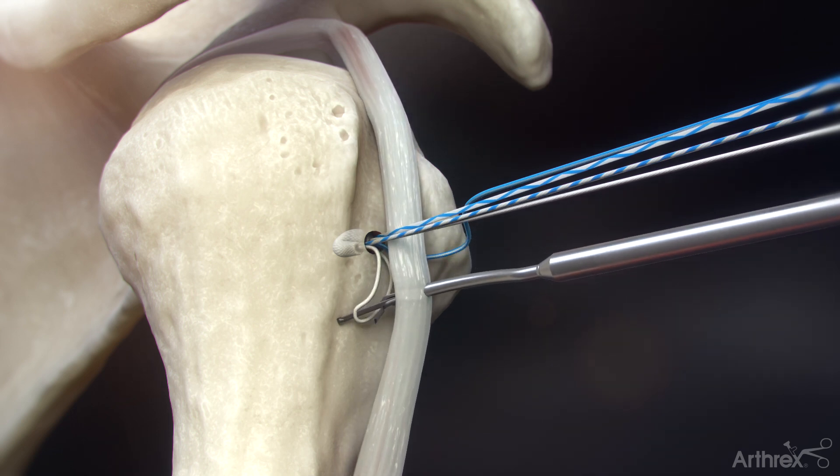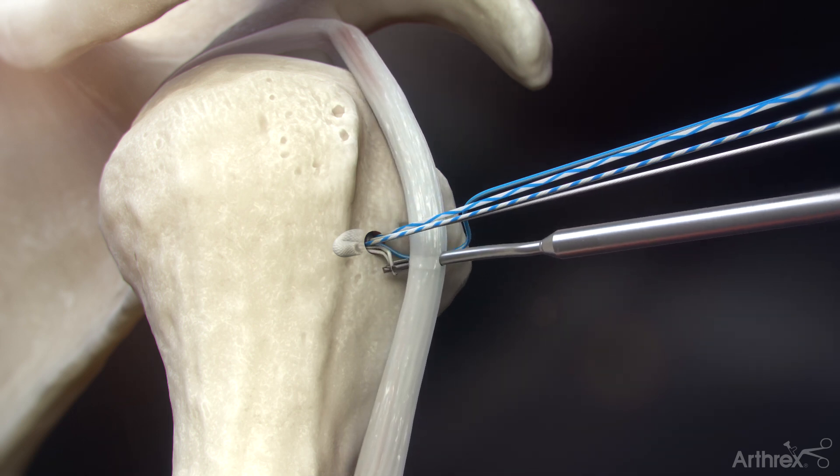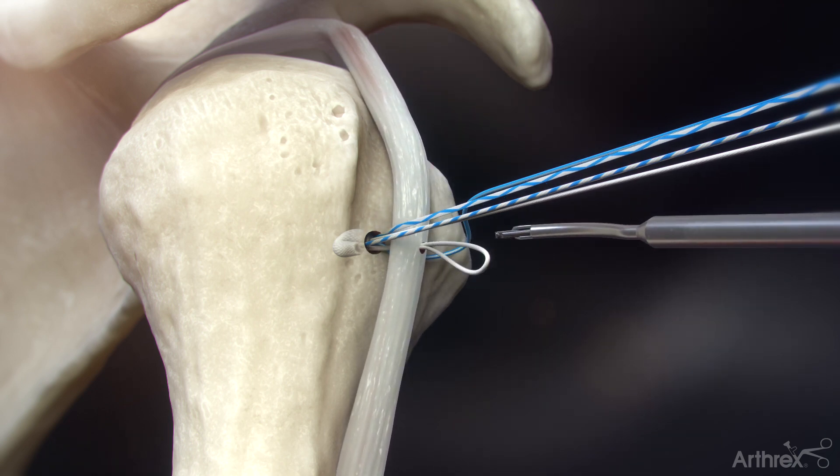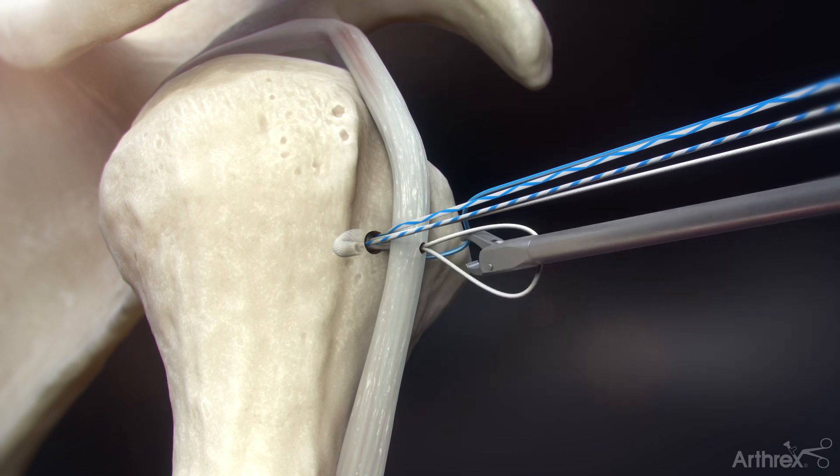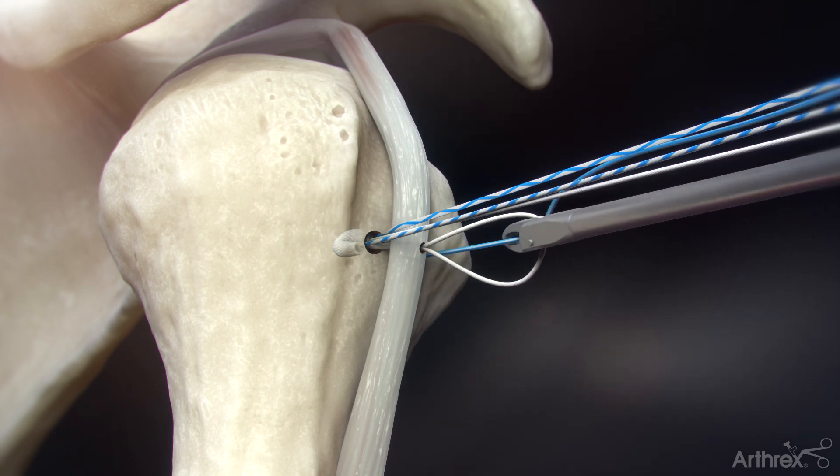Retrieve and shuttle the white tensionable suture loop through the tendon. Using a suture retriever, retrieve the solid blue fiber wire repair suture through the white tensionable suture loop.